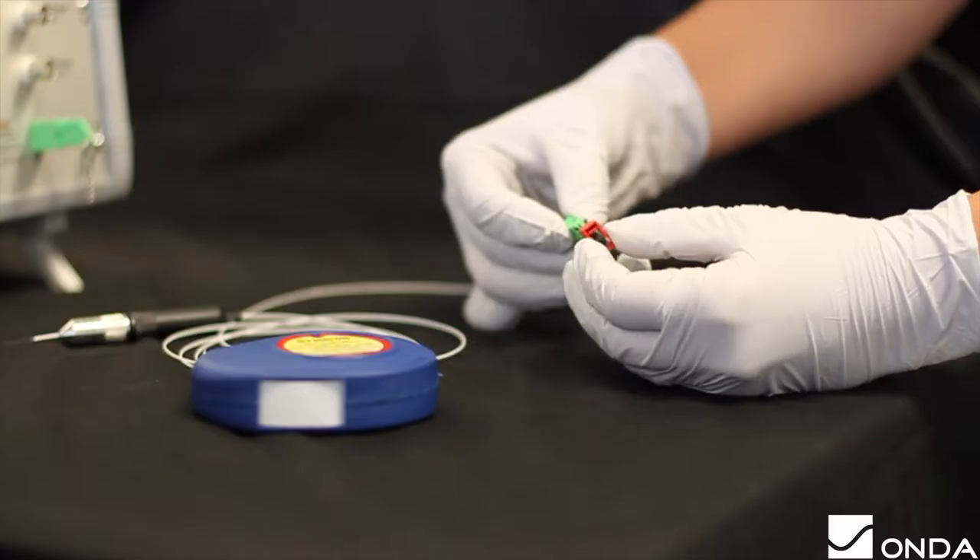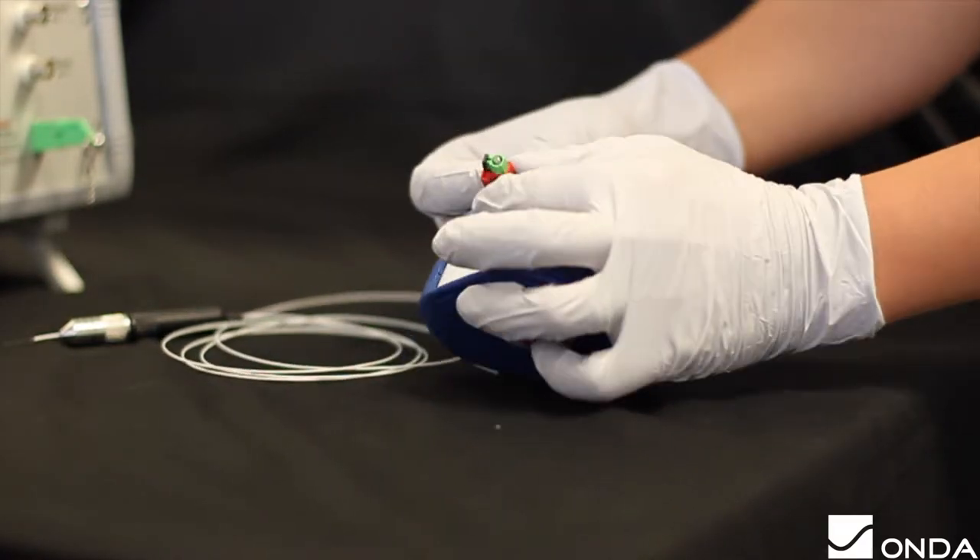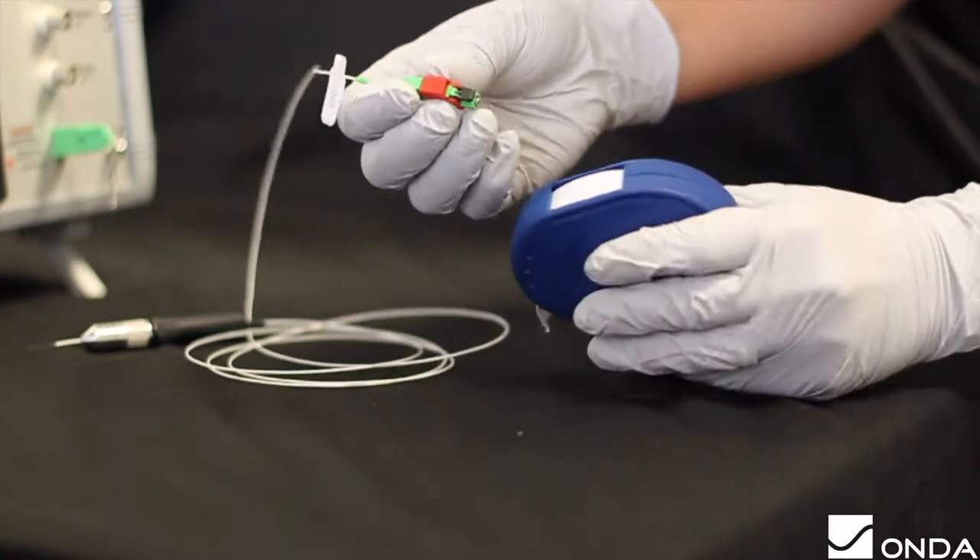While the system is conducting the self-test, clean the fiber optic probe by holding down the connector and wiping the tip across the cleaning tool in a figure-8 pattern.